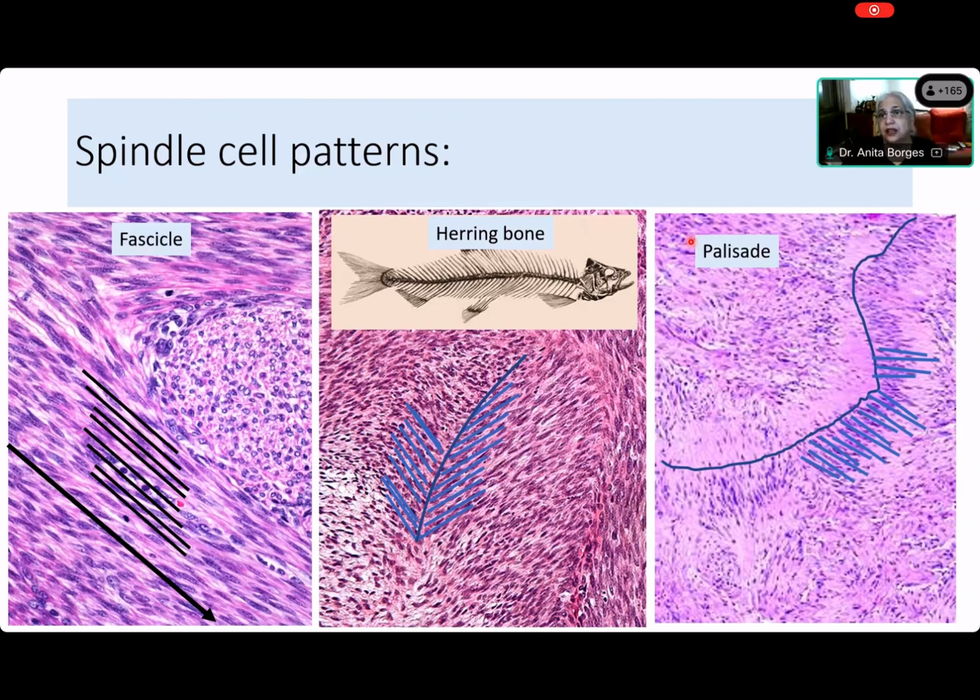Yes, all columnar cells can show you a palisade, right? Because they are all parallel to one another and they are perpendicular to the basement membrane. Yes or no? So to form a palisade, you don't require a spindle cell. But many spindle cells do show you palisading. So will somebody be able to explain that to me now, Kedar? What did you understand about a palisade?